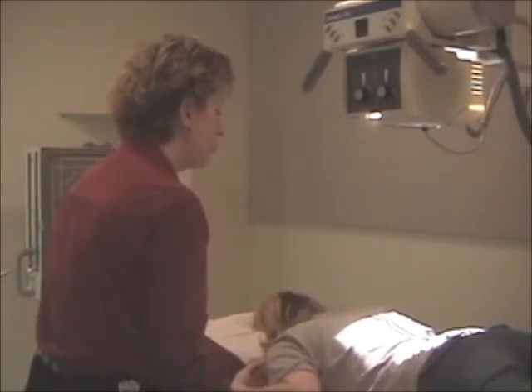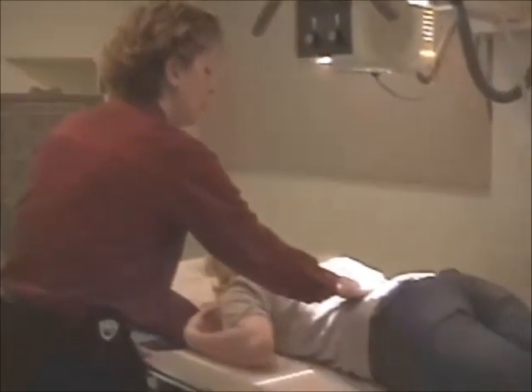I'm going to put the mid-sagittal plane to the center of the film. Arms either both up or both down. I can collimate just a little on this patient. And I'm going to position as if it's a KUB, just to show you here. Here's her iliac crest. And I'm putting the center of the film to the iliac crest.